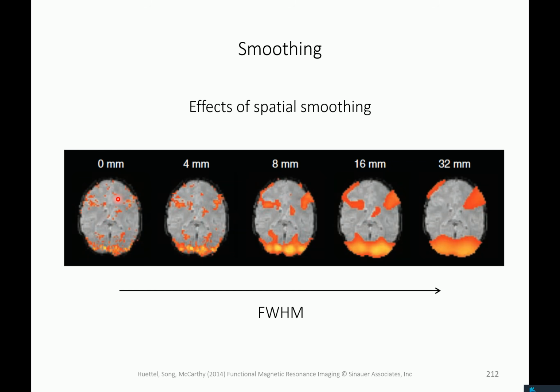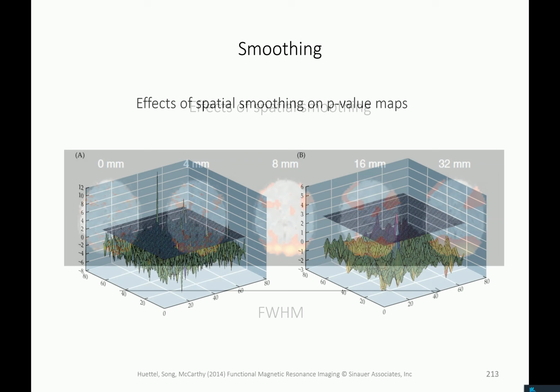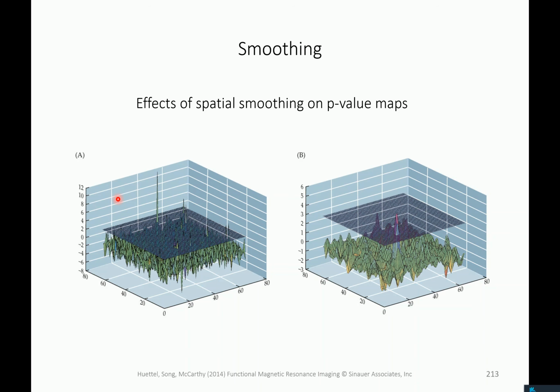So going on there, there is actually a spatial model that also models spatial noise, and this is random field theory, in which the model of the noise is a Gaussian process with a covariance function.